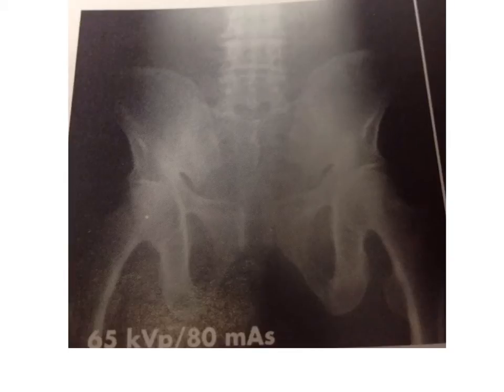So if we're looking at this image, I think particularly it helps to look at the area of the lumbar spine. So starting right here, pretty white. If I dropped an ROI on that, it would be pretty white. This would be kind of gray. I can see an optical difference there. I can see another optical difference there, and then black. So this is a short scale of contrast. It's high contrast. From this white to this black, there's a lot of contrast, and we got there with just a few short steps.